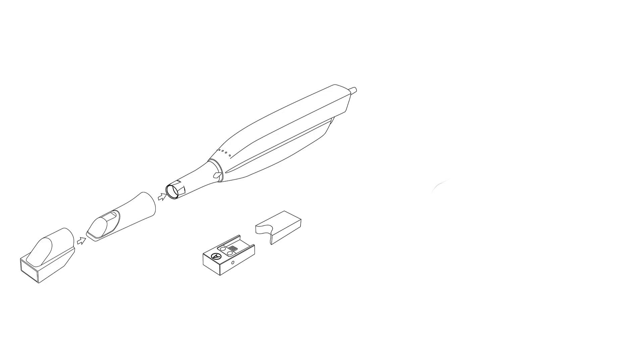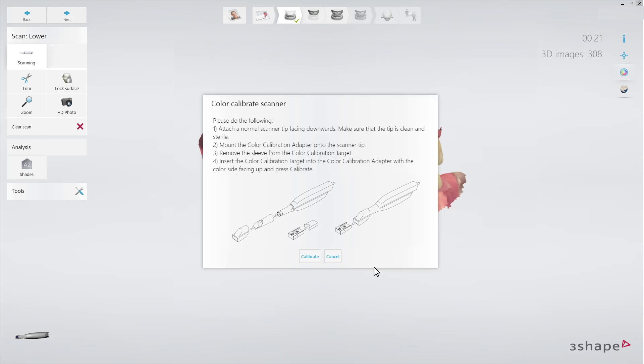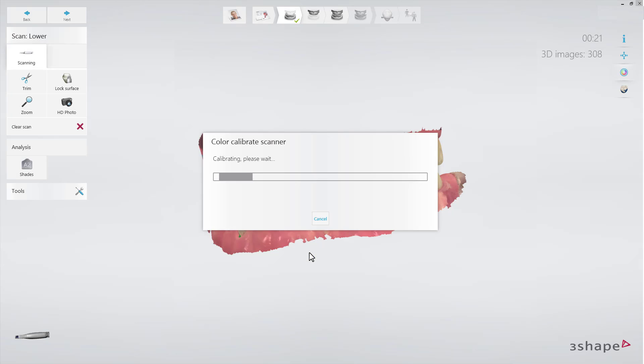Insert the color calibration target into the adapter with the color side facing up and click Calibrate. It will take only up to 10 to 15 seconds.